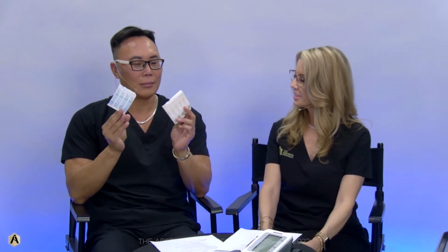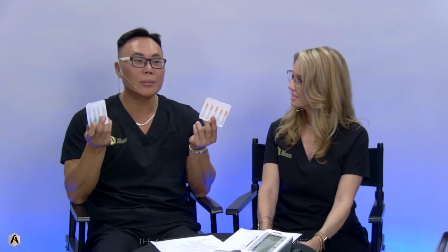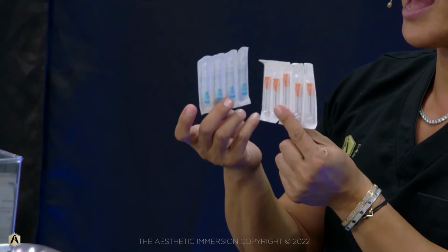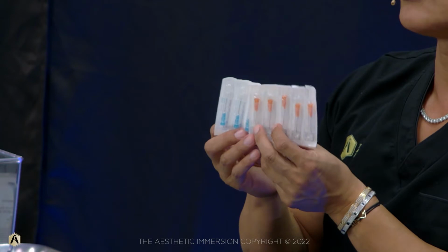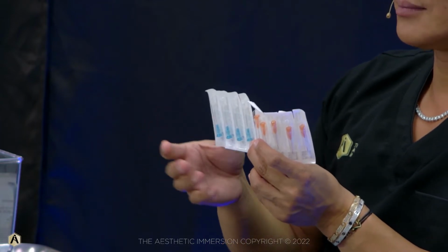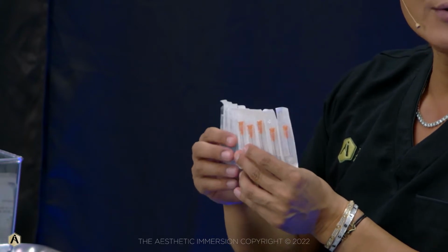I mean, honestly, my favorite things that I can't live without are probably my needles. These are the needles that I love to use. And if you've met me or trained with me or watched some of the videos, I hate the needles that come in the packages. I think they don't do enough. Half inch barely gets into the tissue. Years and years ago, probably at least 10, 12, 15 years ago, I switched to using longer needles. So my favorite one is the 25 gauge 1-inch.